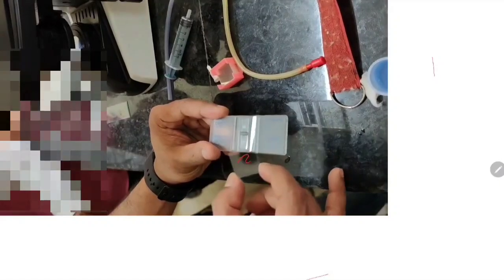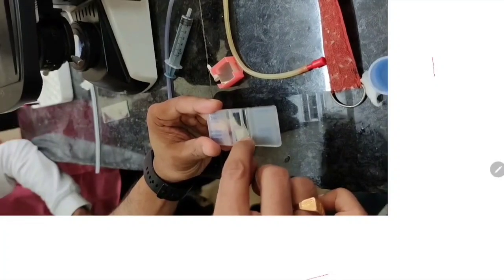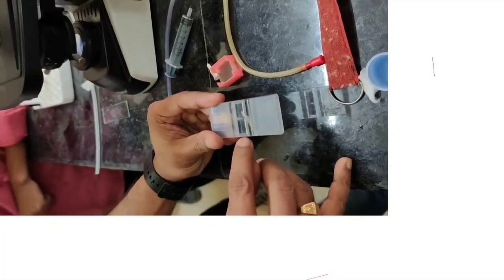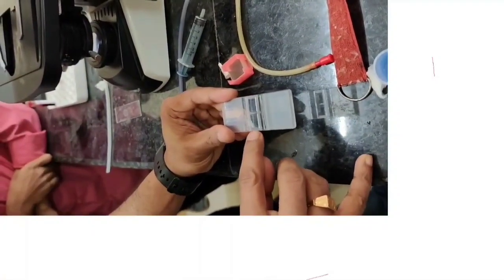So if we put this cover slip, there will be a gap between the cover slip and the central counting area. That gap will be filled with the fluid we have prepared, after discarding the stem part. So first we'll discard the stem part and then fill this area.